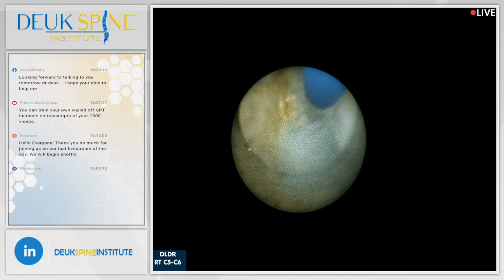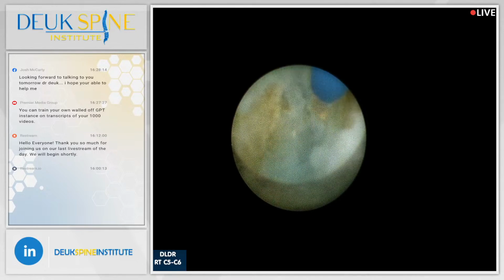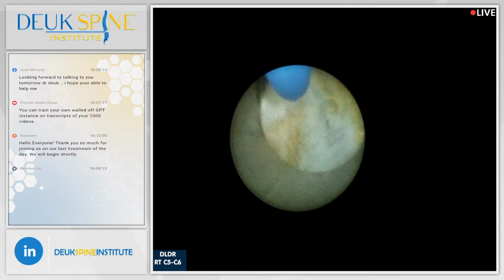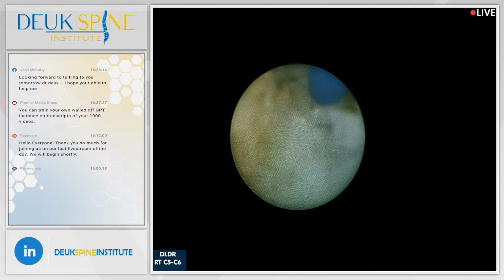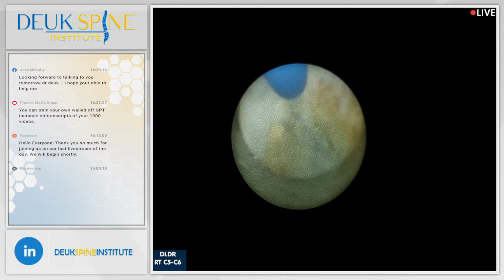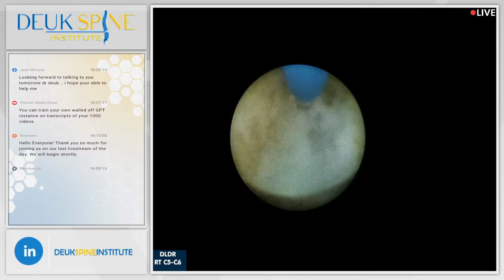What we're seeing here are the fibers of the posterior ligament right there. We're in the foramen where the nerve root is. I'm right above the nerve root, and if you want to be specific, I'm anterior to the nerve root. We're at the back of the disc. We're seeing the tear. You're seeing the bones there on the left and right, the end plates, and we're looking in the foramen right here. Literally looking out the foramen. You can see the giant tear, right? You see that tear? Yes, we do. Now this is a nice disc for us because you can see it's not so degenerated. But there's a giant tear right there. You see the tear? That crack is the tear. And I'm cleaning it so that it will heal. It will heal once we get rid of all the herniation.